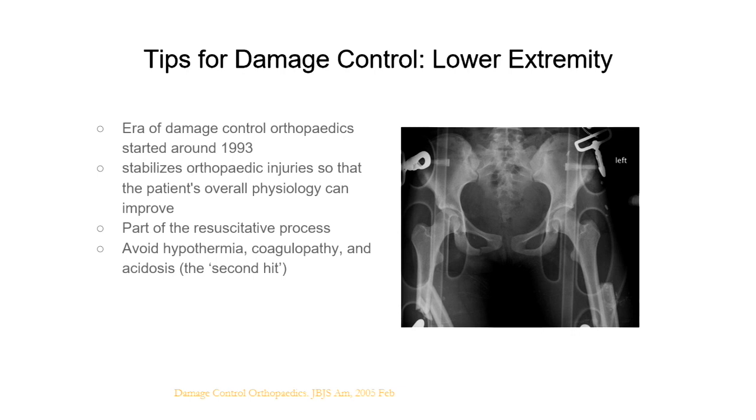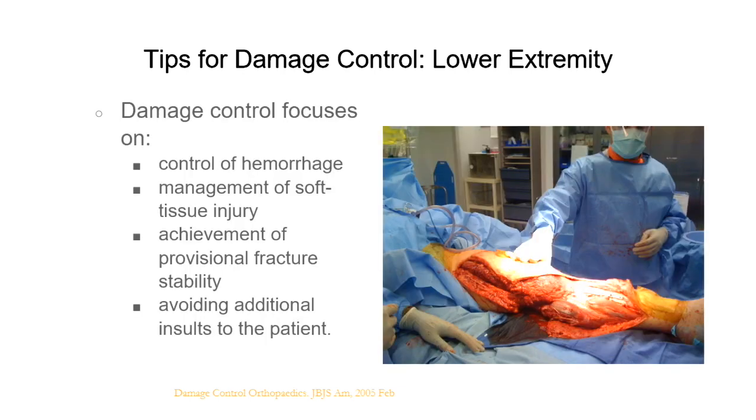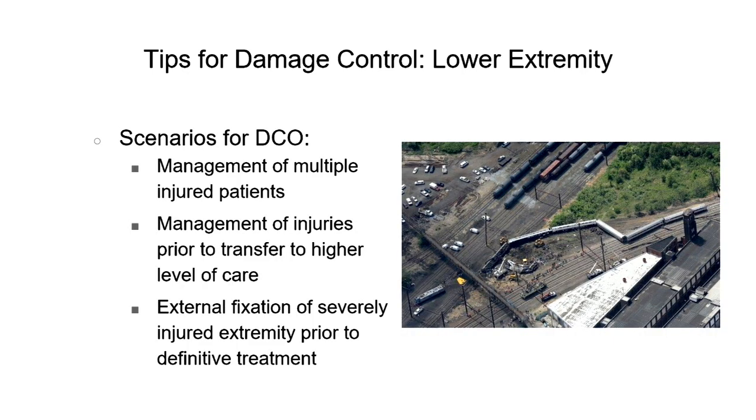It's resuscitative. We actually help in the resuscitative process of trauma patients. What's that focus on? Controlling hemorrhage, management of soft tissues, achieving provisional fracture stability, avoiding insults to the patient. And then around here, sometimes you get busy. Man, I'd love to take care of that patient tonight, but I've got three more that I've got to take care of. Sometimes you have to do some damage control.